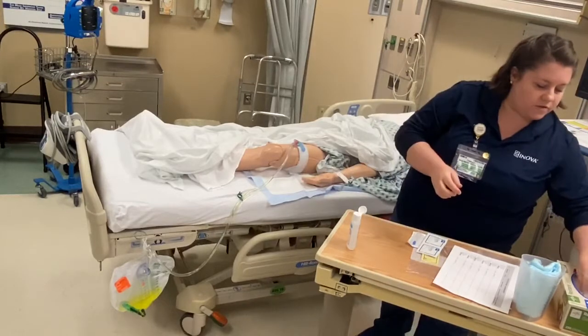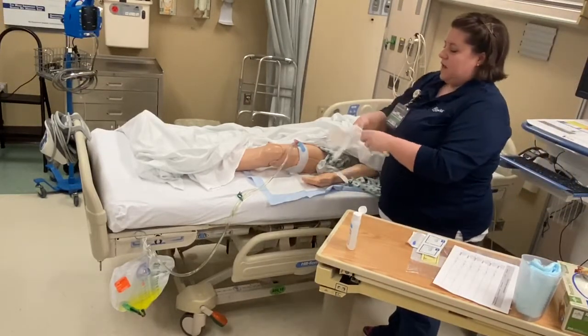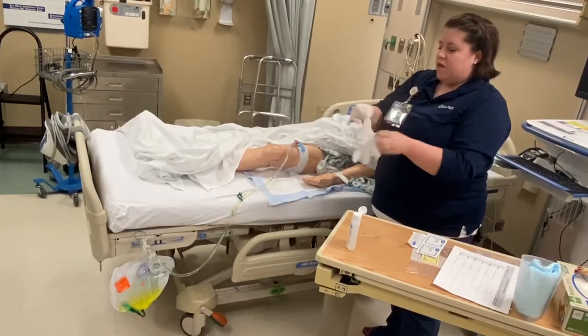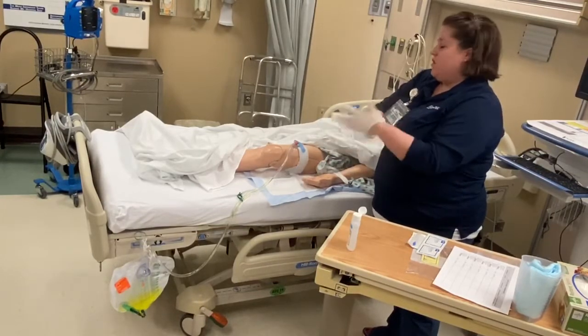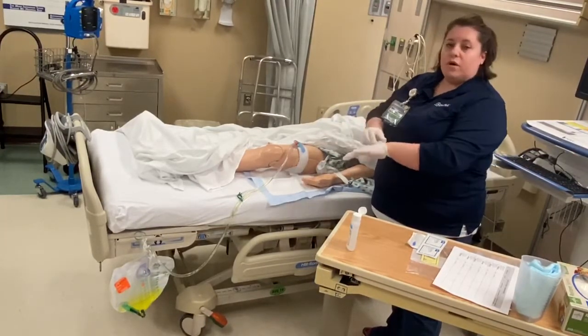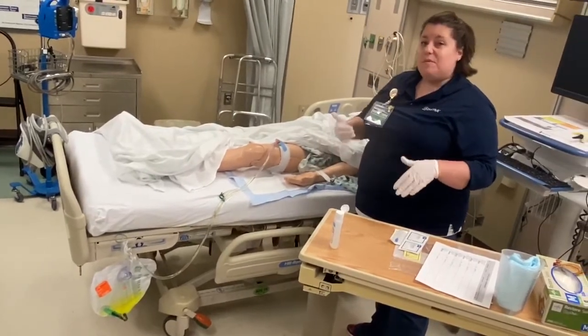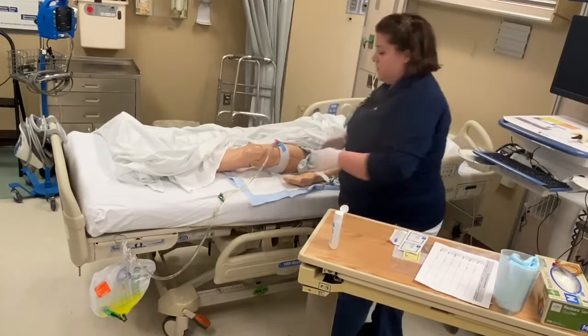I'm gonna put some gloves on. And I'm going to empty the urine from the catheter into the bag. Now, the reason that I'm emptying it into the bag is because I want fresh urine that I'm gonna collect from a port right here. You never wanna collect a urine sample from the bag because that urine could be contaminated and won't give a correct result.